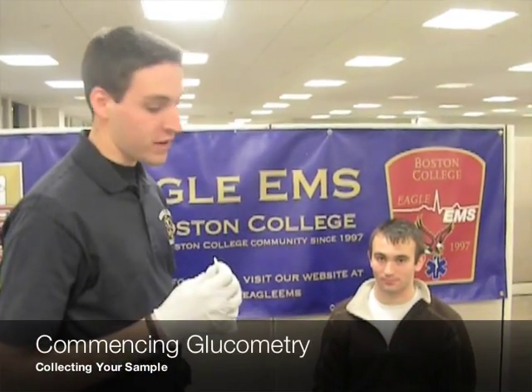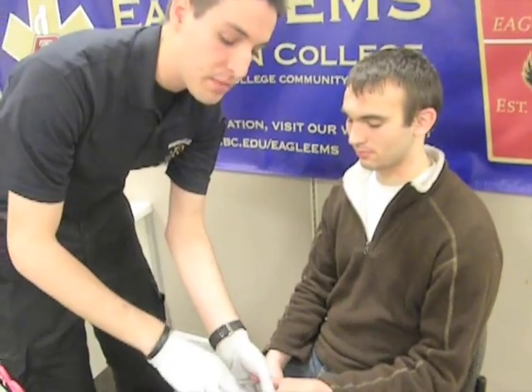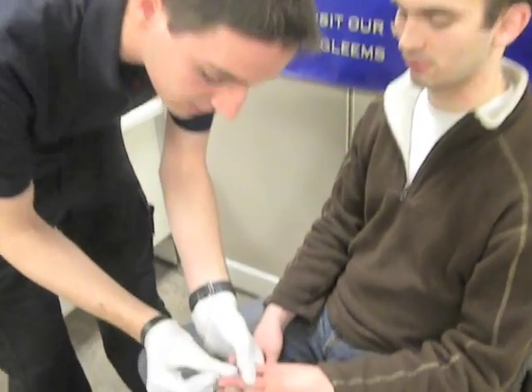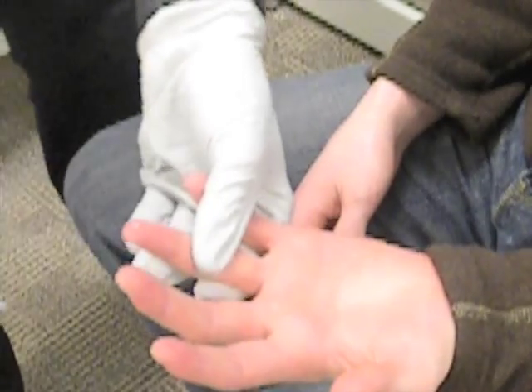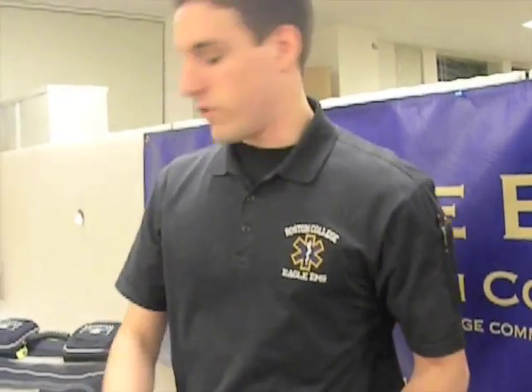Now we're going to select our finger for glucometry. It doesn't matter which one you use — you can ask your patient. It's nice to avoid the tips of the fingers because that's where most of the nerves are, so it's probably going to hurt them a little more. And it's nice to use their non-dominant hand, just because there could be some tenderness or soreness over the next couple of days. We're going to get the side of this finger here with the alcohol prep pad. We want to make sure that we let that dry, or else it could throw off our reading.